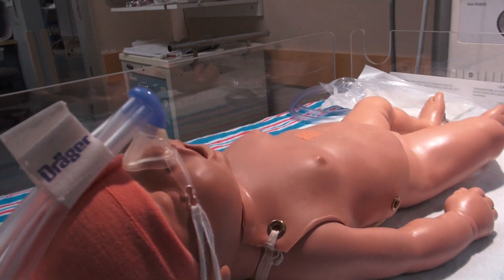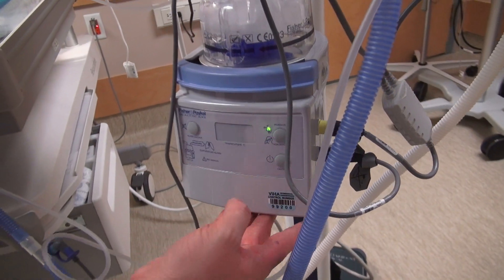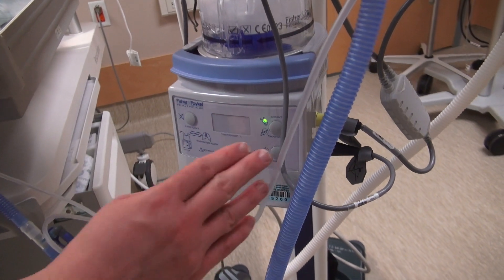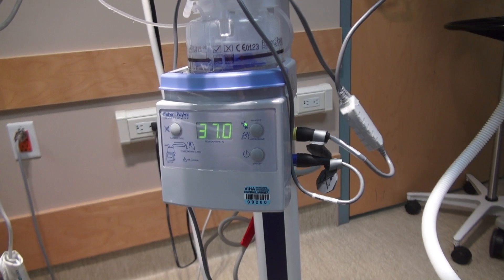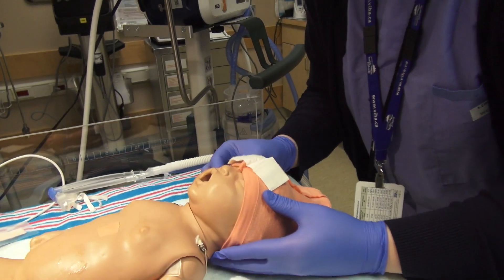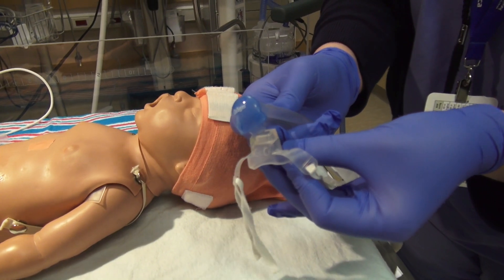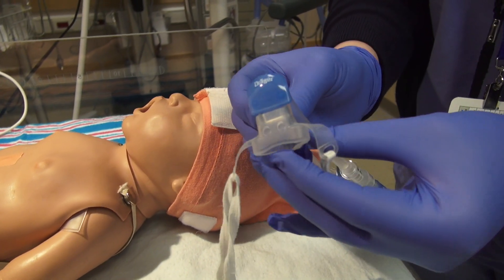Starting nasal CPAP ventilation. Once your pre-op checks are complete and your humidifier is at proper temperature, apply the nasal CPAP mask to end of circuit and attach it to the newborn's face. Secure with ties to the bonnet.